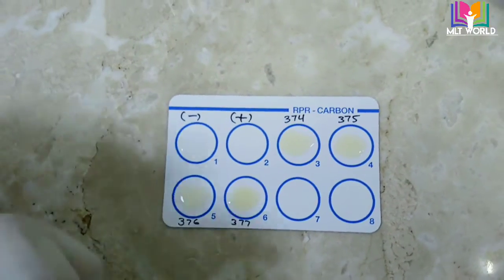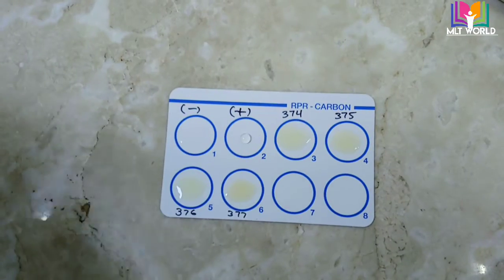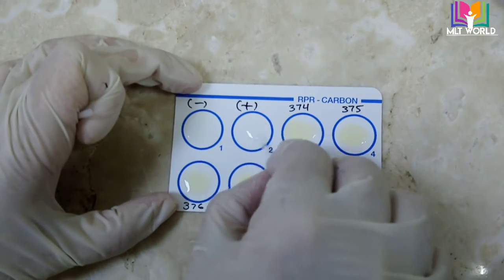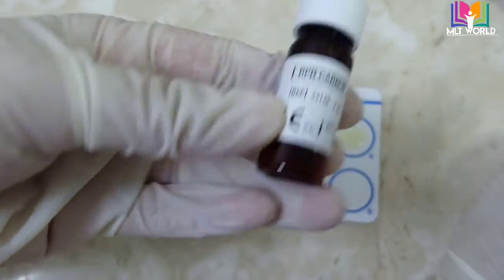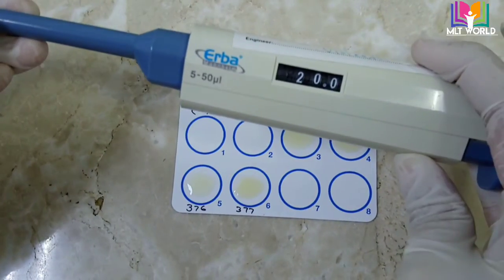Take one drop of positive control and place it in its designated circle. Be careful — it should not touch the patient sample area, because if it does it will cause a false positive result for the patient. Now we will add 20 microliters of RPR carbon reagent into each circle.